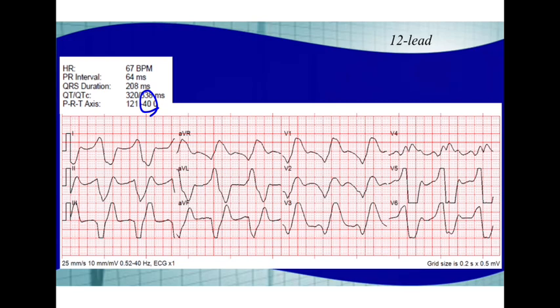Well, that should be like a red flag, because if we're thinking tricyclic antidepressant overdose, they would have some sort of depression and they missed their appointment with a psychologist or a psychiatrist. Or if you're thinking something cardiac, well, it's a 31-year-old male. It doesn't really fit that unless there's significant cardiac history. So you've got to get the history, because every 12-lead comes with a patient.